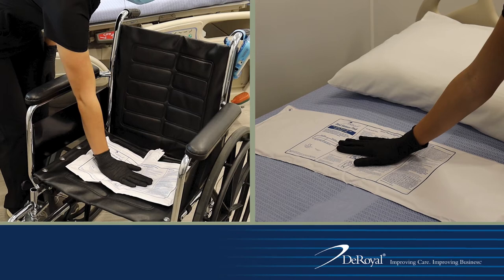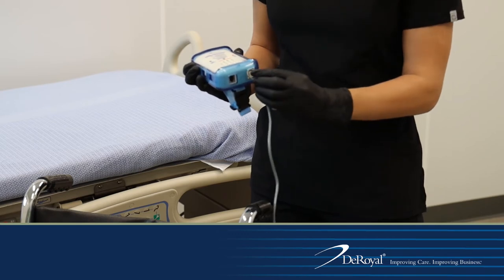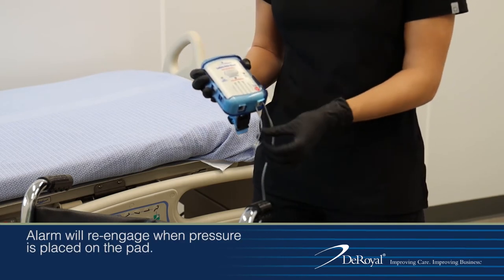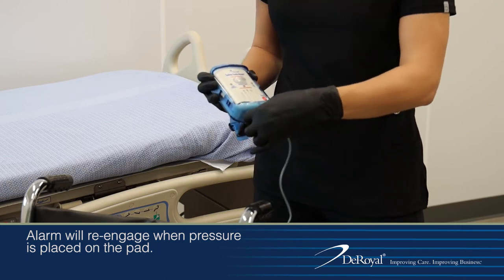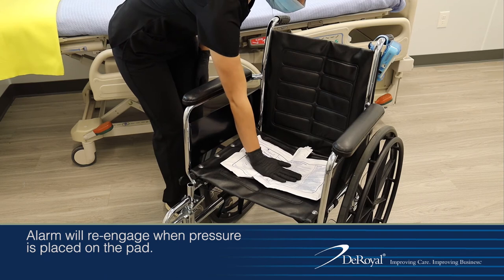Choose a desired location on the bed or wheelchair to place and/or attach the monitor. To test the alarm, connect the sensor pad cord to the monitor. Make sure to wrap the cord around the anchor located on the bottom of the monitor. Place pressure on your sensor pad.